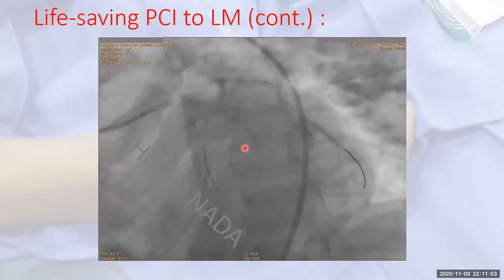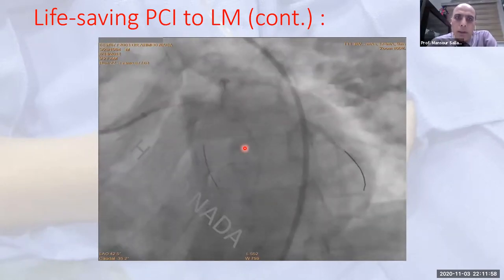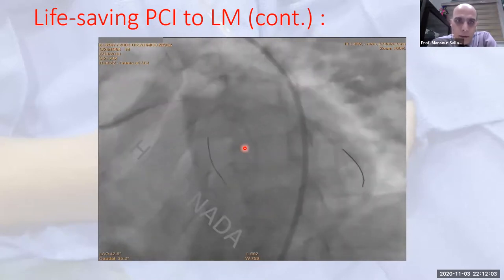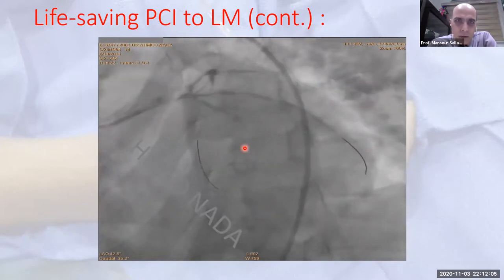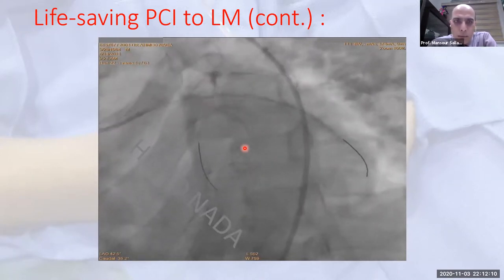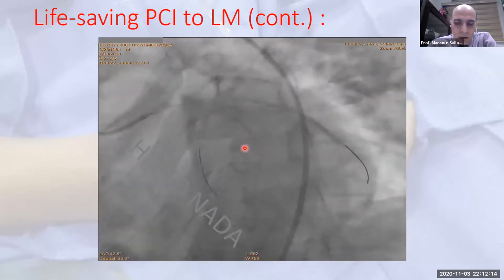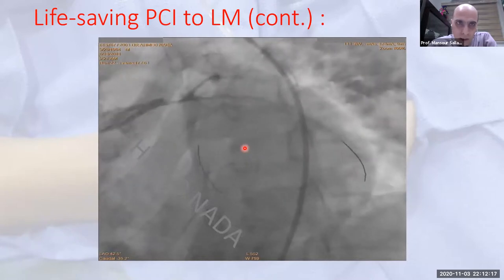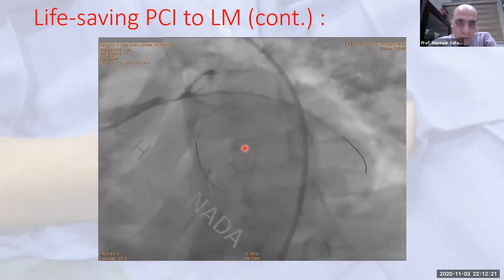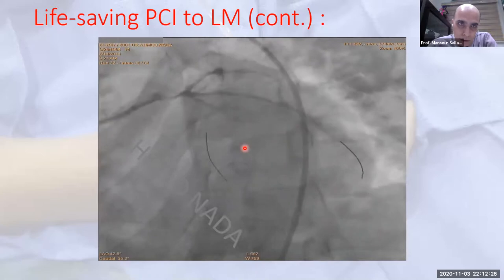Okay. Dr. Mansour. No, I think despite the blood pressure is expected to be low, I would like to use a small dose of nitroglycerin in such a situation. Sometimes I can give intracoronary norepinephrine, a small or recommended dose. Exactly as Dr. Hatem mentioned, I will use a glycoprotein 2B3A receptor antagonist, but I will never use thrombolytic therapy here in such a situation. So I think this is in my hand. After that, I think I can stent from the left main to this large vessel and establish flow.